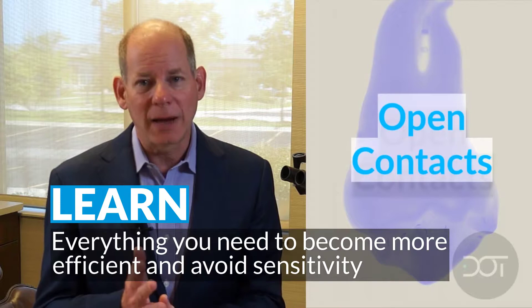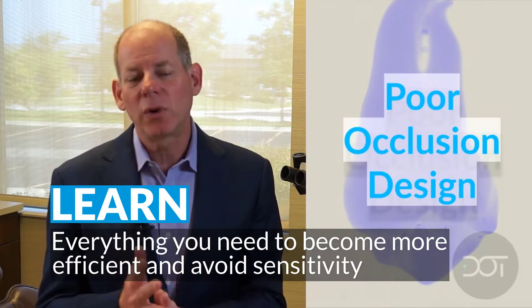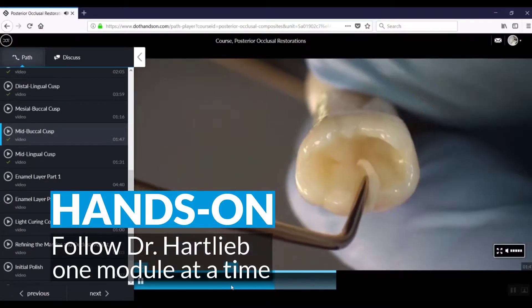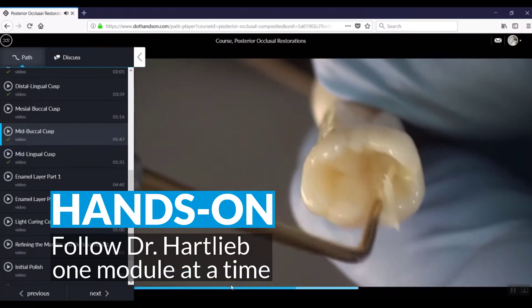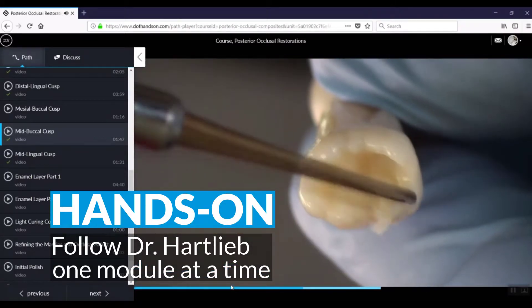or open contacts, or just poor design with the occlusion. You can really lean your multi-use instrument into the tooth form to really tighten that anatomy.